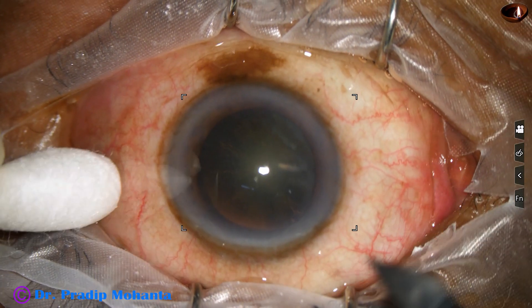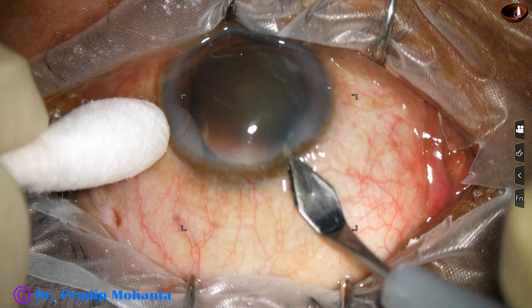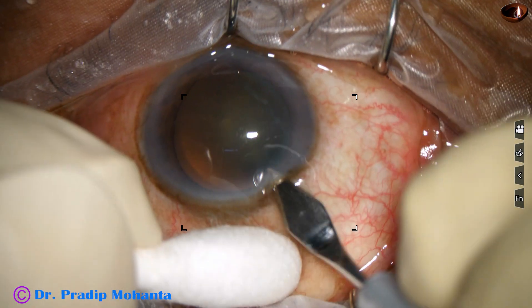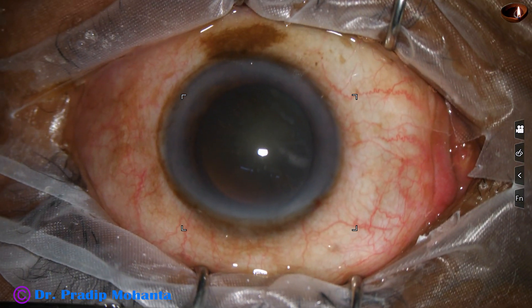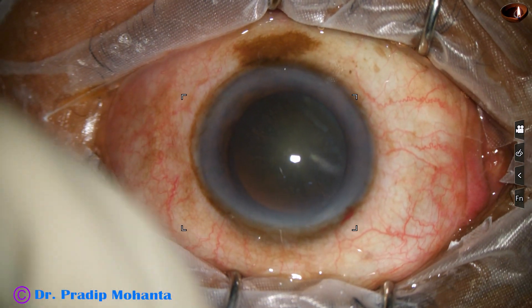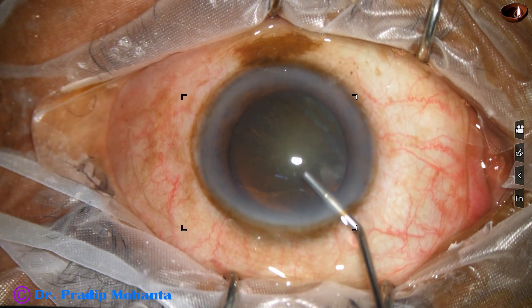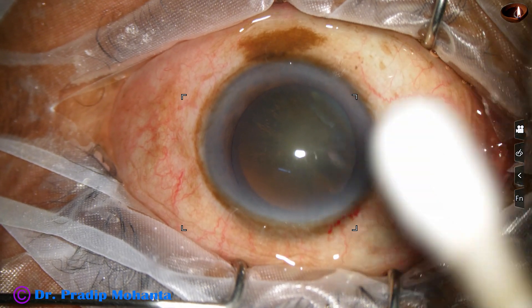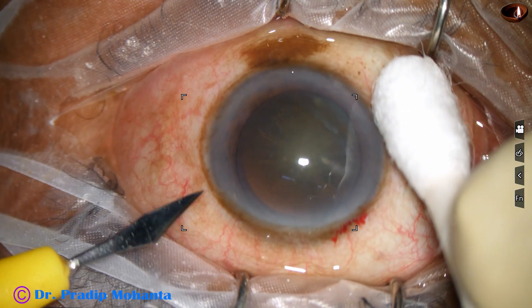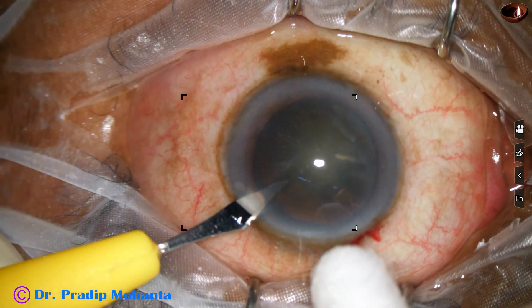Nuclear sclerosis is about grade 2 plus or maybe grade 3. This is the main incision with a 2.8 millimeter steel keratome, and now the anterior chamber is filled up with 2% hydroxypropylmethylcellulose. A side port is made about 3 o'clock hours away from the main incision.